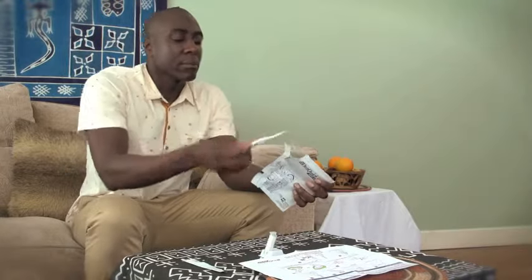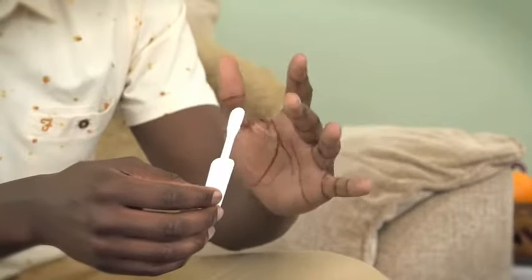Next, find and remove the test stick. This small packet is for storage only and is not needed for the test — throw it away. Make sure you don't touch the flat pad.